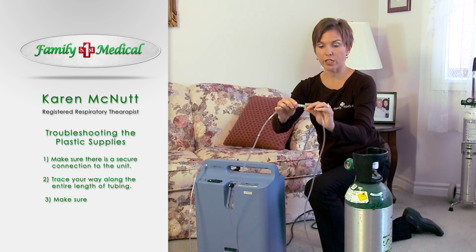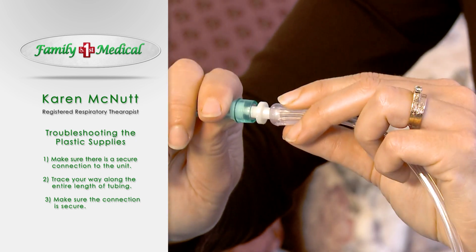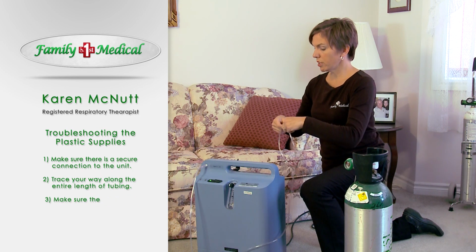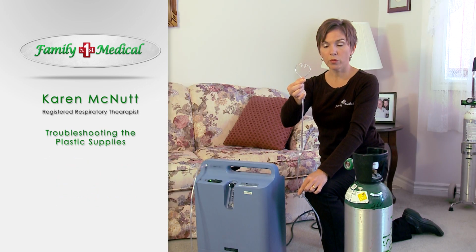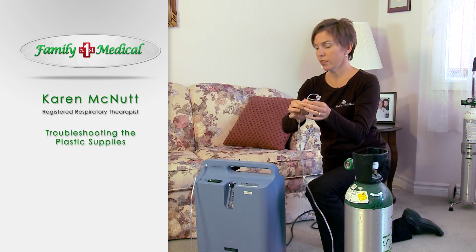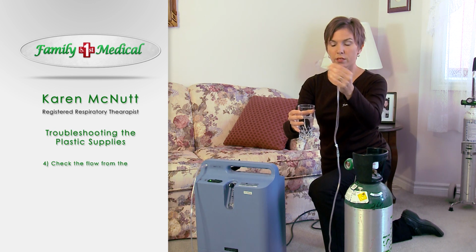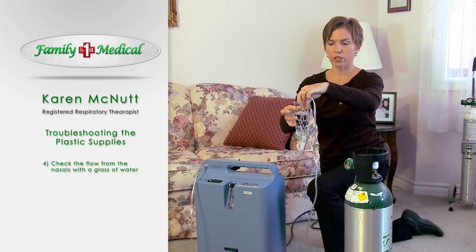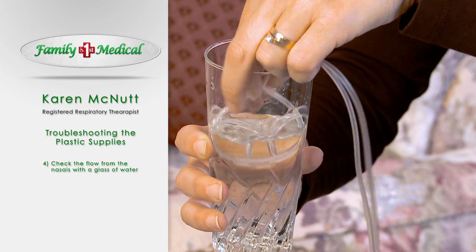When we get to the connection, we want to make sure that that is also secure. Once we've checked the connection, we're going to continue along the length of the tubing until we come to the nasal cannula. When you get to the nasal cannula, we're going to take a glass of water and simply check to make sure that the flow is coming through the concentrator. Dip the nasals into the glass of water. When the concentrator is functioning normally, you'll have bubbles in the glass of water like we do today.